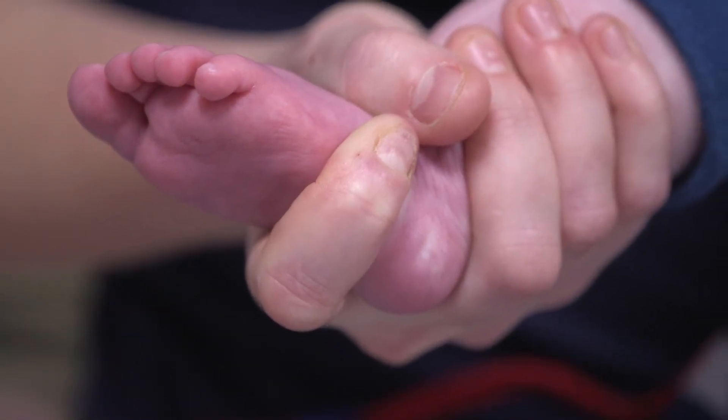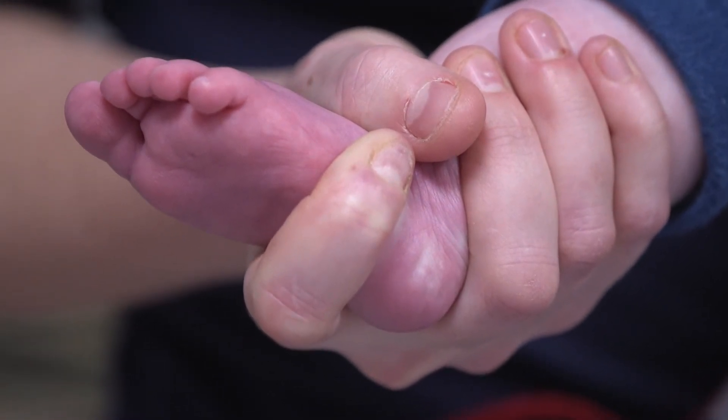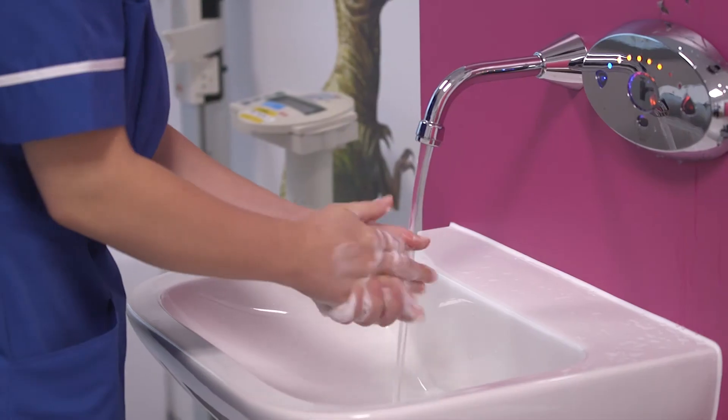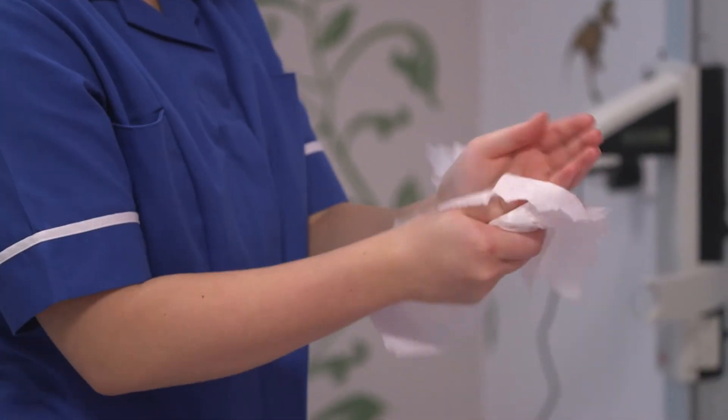Make sure your child's foot is warm. This can be done by putting their foot into extra socks or blankets around them. However, do not apply anything hot to their foot as this may cause scalding. Once all of these things are ready, you need to wash your hands.